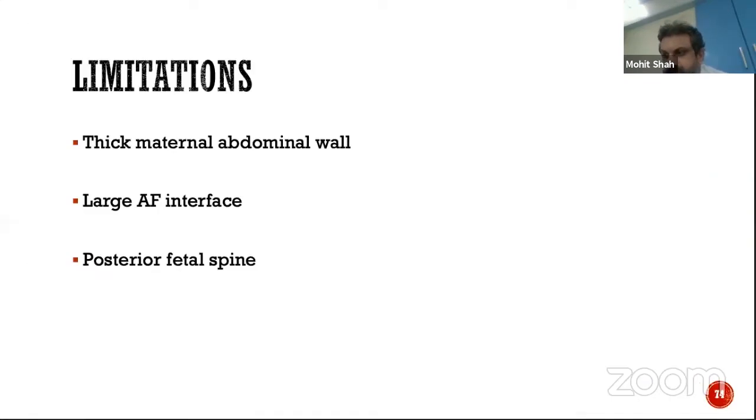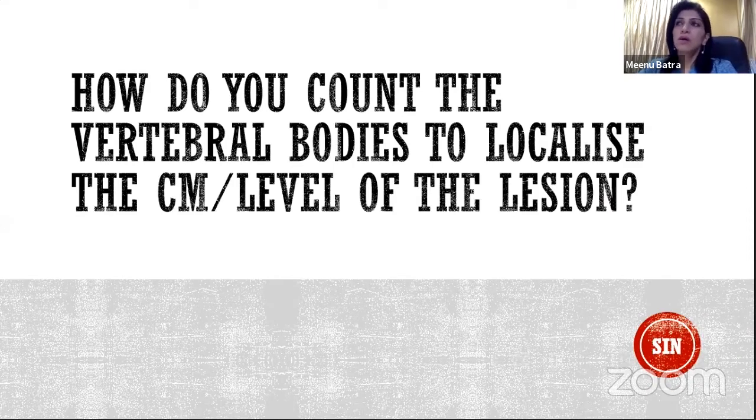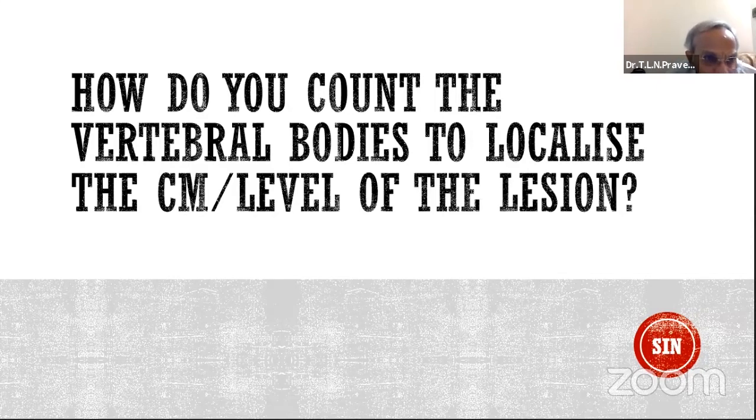Yeah. So Seneesh, sorry to interrupt. Meenu, yes, Dr. Suresh wanted to ask something from Dr. Ramamurthy. Yes. Ramamurthy or Mohit, you said the conus ends at the level of L2. So how do you identify L2? That's the question which is going to Dr. Seneesh now. Dr. Suresh, how do you count?